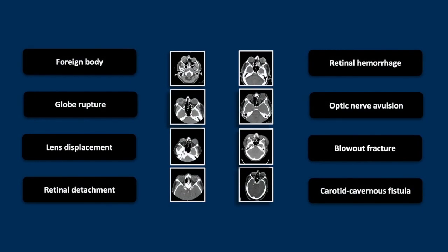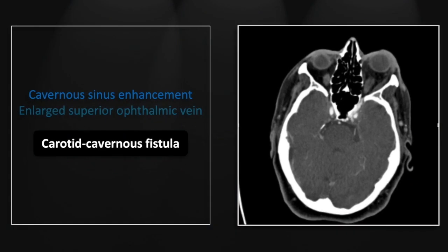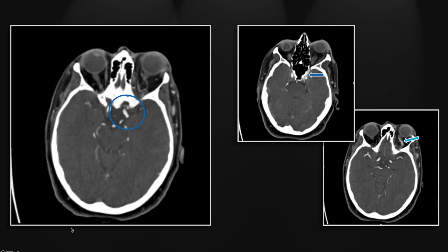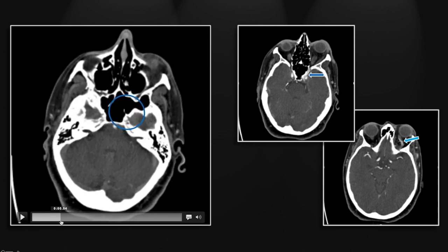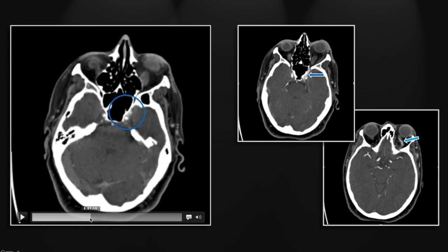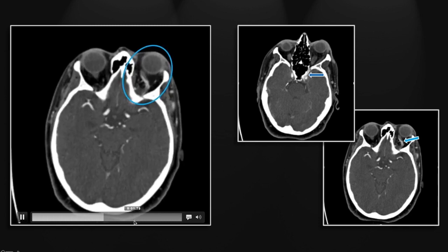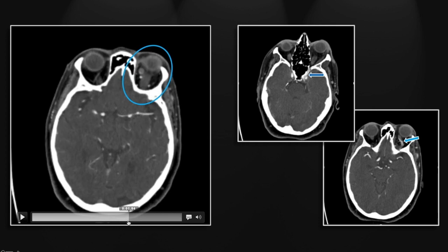The last case is a carotid cavernous fistula. Initially there is asymmetric cavernous sinus enhancement, and the first thing you'd want to check is the superior ophthalmic vein, which you can see is prematurely enhancing and significantly enlarged. Following the fistula, you can see contrast immediately adjacent to it filling the cavernous sinus, which then extends out into the enlarged superior ophthalmic vein — a very nice demonstration of a carotid cavernous fistula.